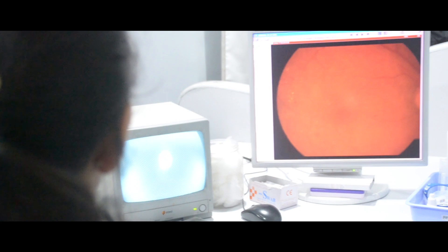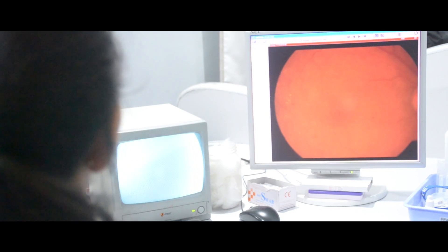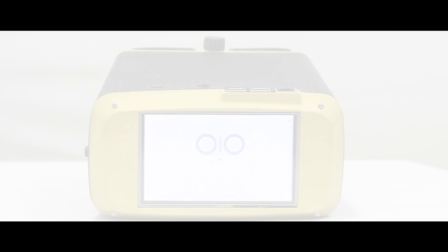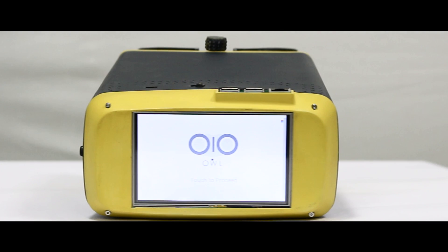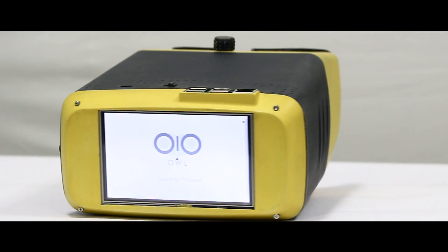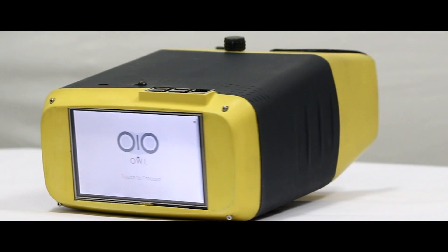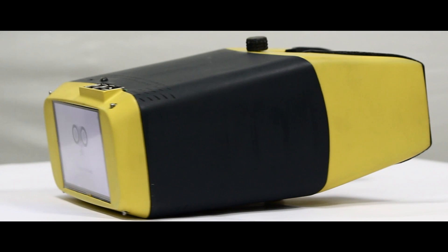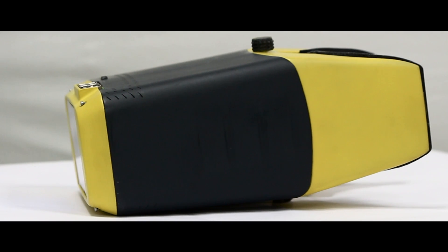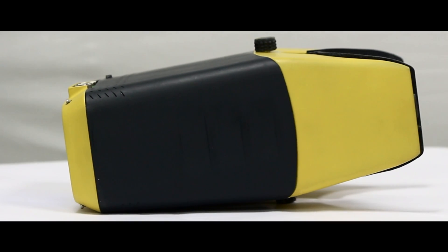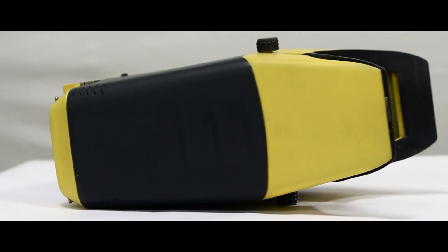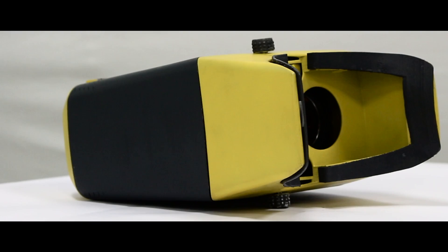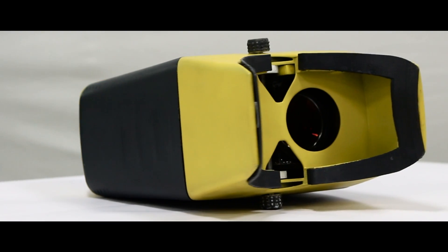So how do we make diagnosis of diabetic retinopathy affordable, accessible and high quality? The open indirect ophthalmoscope is a portable retinal camera that uses machine learning to make diagnosis not only affordable but also accurate and reliable.